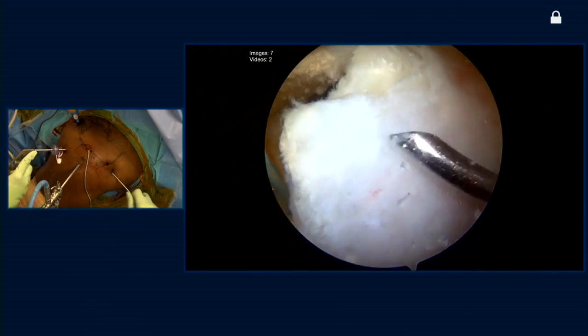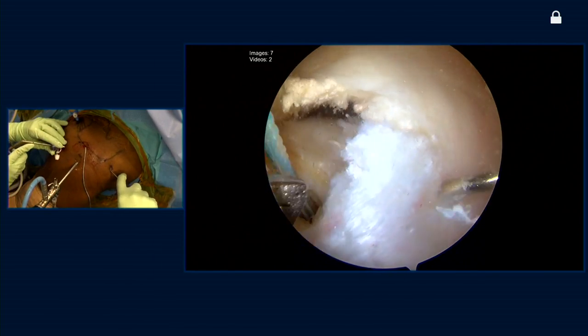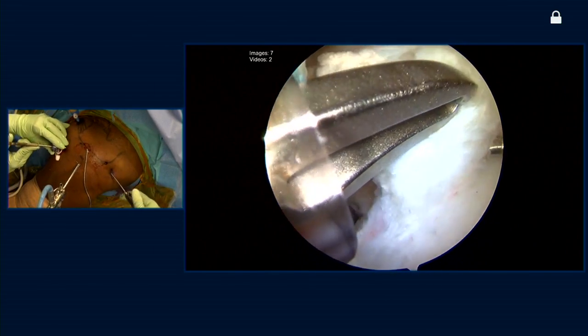I'm going to come in here right at the corner of my tear and put in this cinch stitch. This hopefully at the end will help me to deal with the lateral margin and the dog ear portion of the tear.